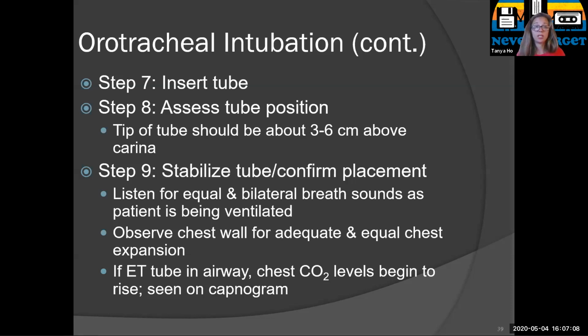So you want to listen over the tummy first. We always recommend that you listen over the stomach first, because if you hear gurgling in the stomach, right away you know you're not in, okay? Sometimes if the patient's perfusion is poor, you should see CO2 detection, but if you do not, you give another breath, and then you're like, wait a second, go again, and you give another breath. And some places don't even have a CO2 detector, so you have to rely on your other skills. Don't let that be your only thing, like, I don't know if it's in or not because I don't have a CO2 detector. You have to have your other ways of knowing whether it's in, okay?